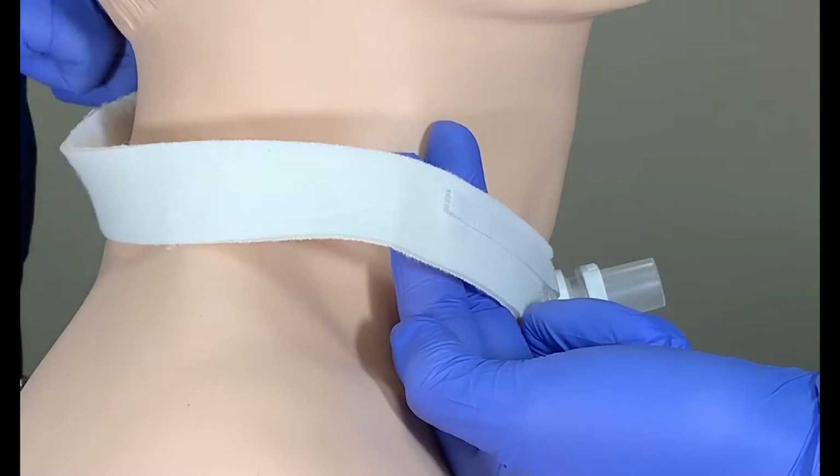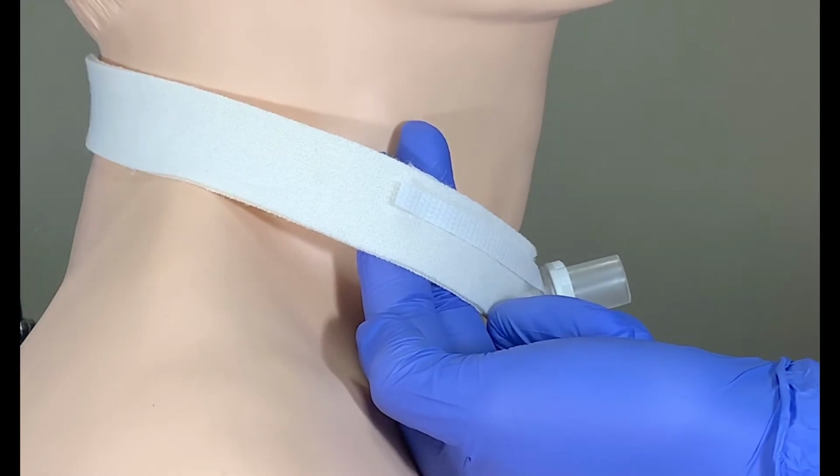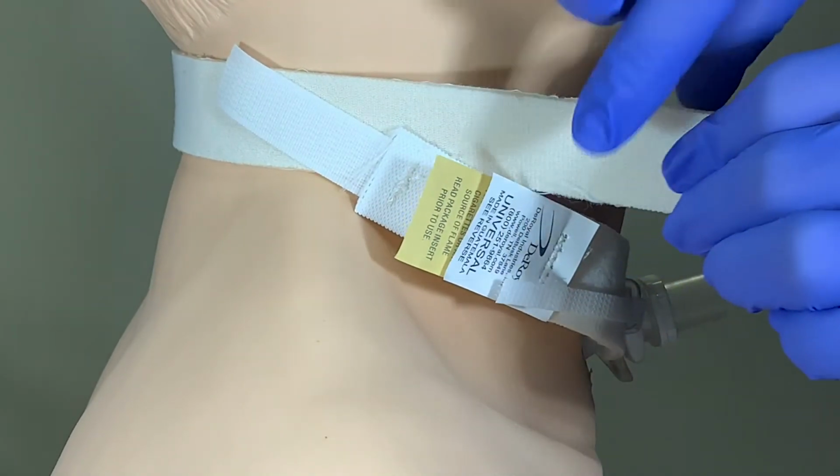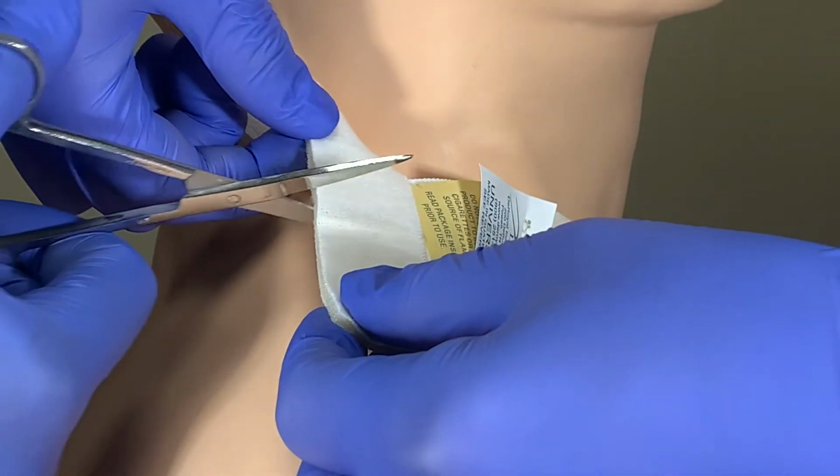The ties around your neck holding your tracheostomy tube should typically be changed at least every several days. They can be changed more frequently if they become soiled. When tightening your tracheostomy ties, you typically want to be able to put 2 fingers between the tie and the skin of your neck. You may need some assistance when doing this. After tightening it, you may notice there is some excess length on the collar. This can simply be trimmed with scissors.